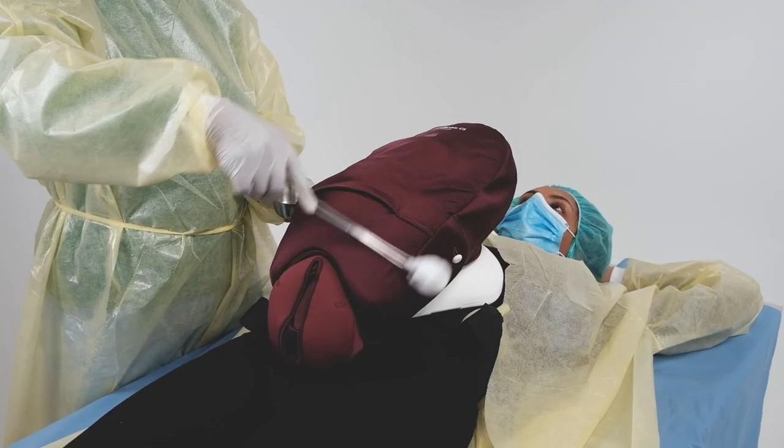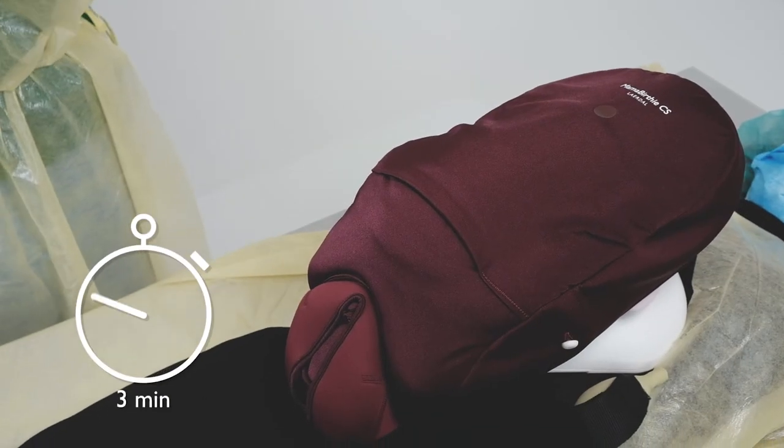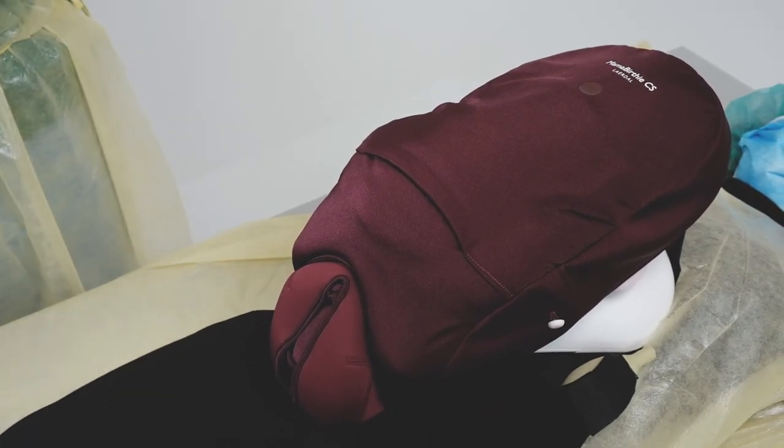With a new swab, enlarge the surgical prep area in circles. Allow the area to dry for three minutes before you drape the client.